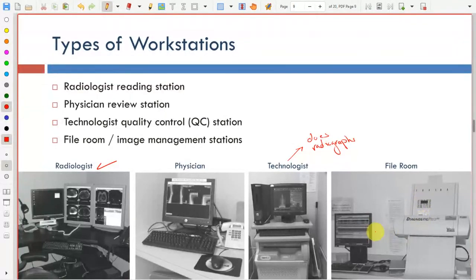So basically, it's like a conversion or like a gateway for films or film-based radiology systems into the PACS system. Otherwise, you will have two independent and two parallel systems, one using films and one using digital images, and basically it's extremely difficult to work with two such systems. So basically it's better to just take the film that you have and convert it to digital, and basically ask the radiologists even to look at them in the digital format rather than the film format.